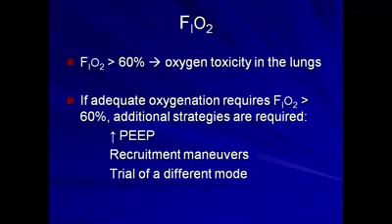Patients in whom these additional strategies are not sufficient to allow the FiO2 to be brought to 60% or lower are occasionally said to have what's called refractory hypoxia. At this point, they may be candidates for some rather extreme measures, particularly if at an academic institution. These might include things such as prone ventilation or ECMO. These will be discussed at a future lecture.